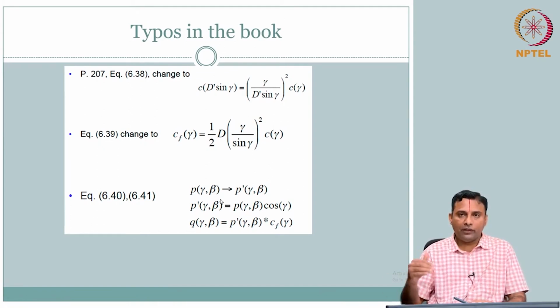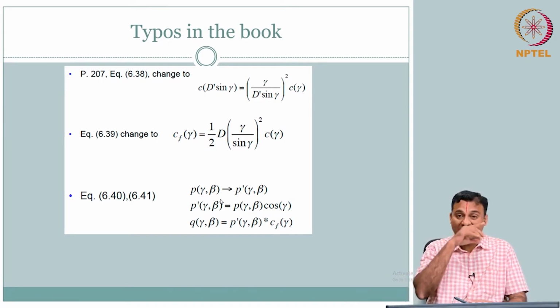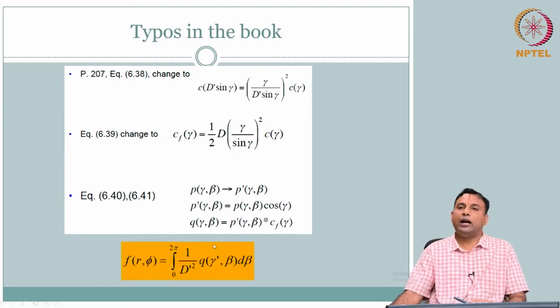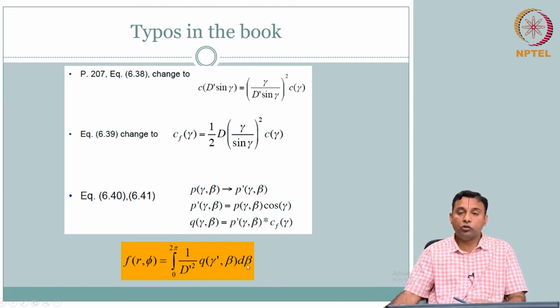So you start with your known back projection formulae, put in this geometry so that d, L, cos theta, all the terms were there. All that you have to change is theta; we have the relationships. So you substitute back and you get a very similar looking back projection. If you do this for convolution, for example, you will get the image in r comma phi coordinates. This is the same: 0 to 2 pi, a sum over all the views. That was theta, here it is beta.